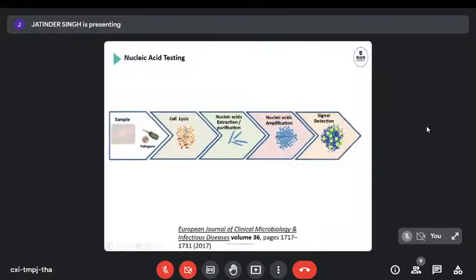But today we're not talking about the fundamentals of nucleic acids, the way they coil, ways to make aptamers. We'll be focusing on nucleic acid testing. And in nucleic acid testing, we have a number of different steps in different parts of the analytical workflow. We start off with a sample that contains the things that we want to test for. Quite typically, we'll test for pathogens. So you can see some E. coli and some other microorganisms sitting here in the sample.